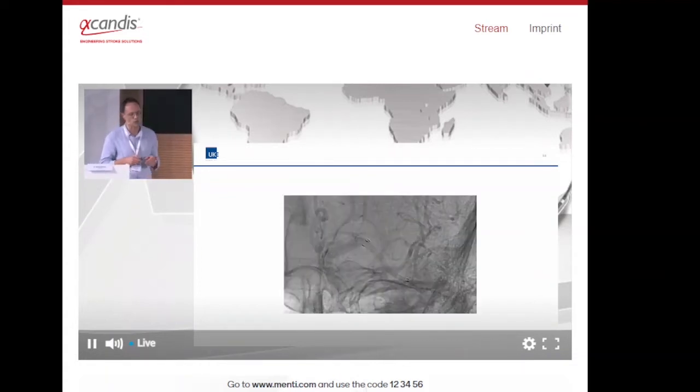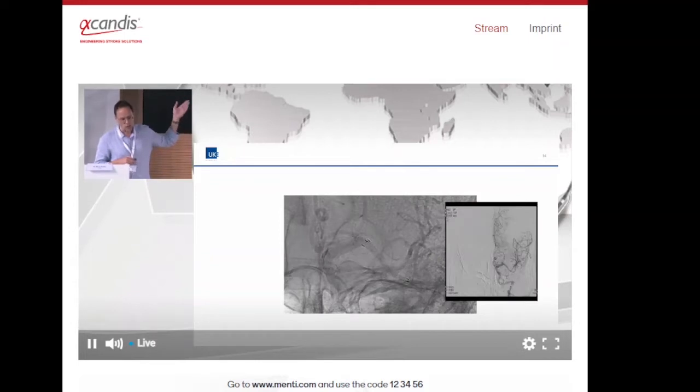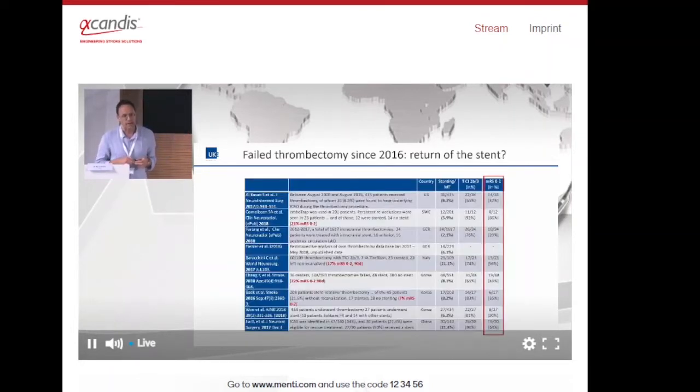This is what we've seen through all the cases. And permanent stenting in ICAD is the solution, I believe. We heard about angioplasty, but some kind of mechanical removal of the stenosis. Actually, this is what we did in this patient. We didn't have any clues that it was underlying ICAD, but everything went fine, so we were lucky in the end. And the patient was discharged without any clinical problems.